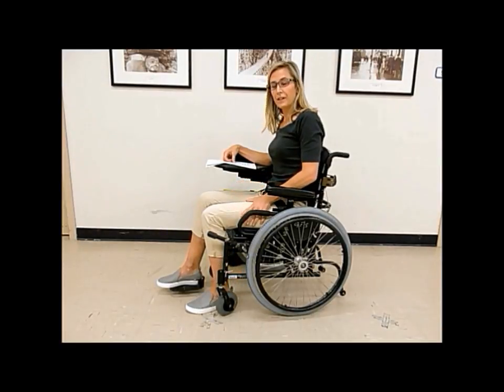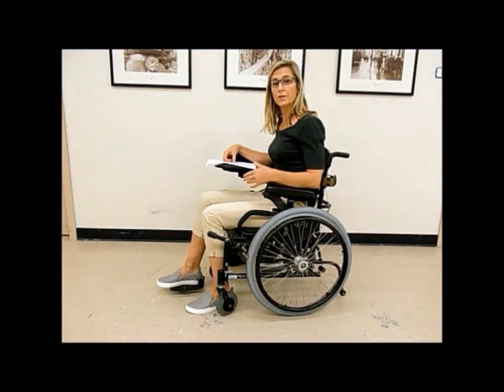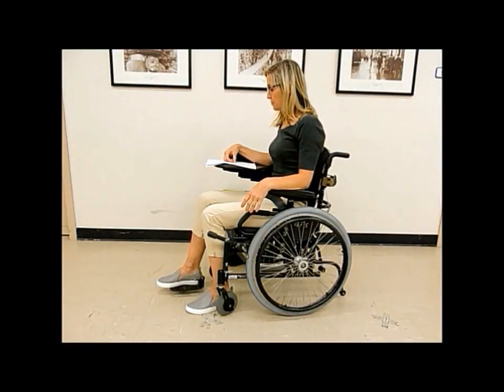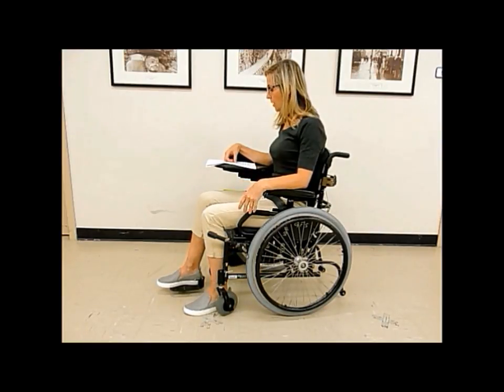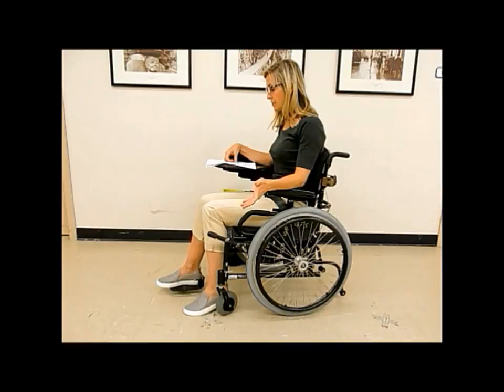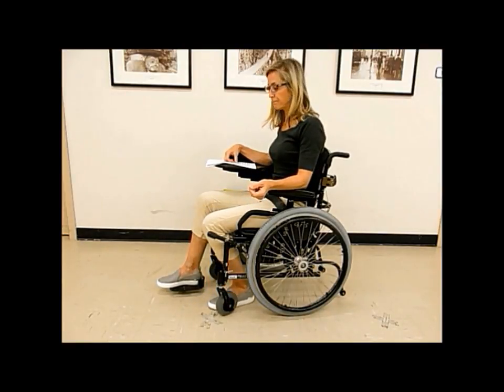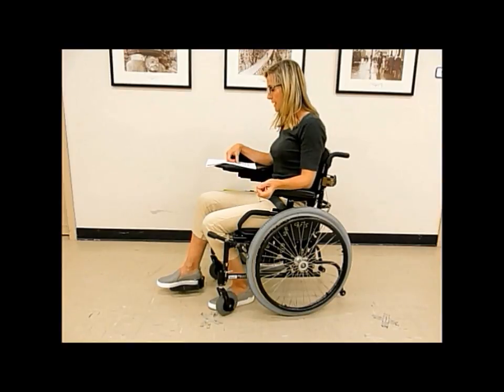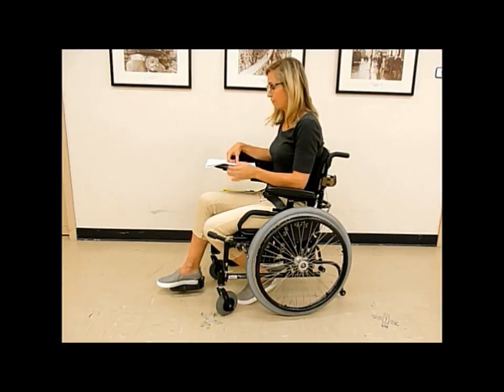A foam cushion is typically more appropriate to allow for more stable base rather than something like a Roho, which is an air cushion, which provides more pressure relief but less stability while you're wheeling. Of course, if the client has skin issues and requires a pressure relieving cushion, that will take priority. The cushion may need to be cut down on the leg trough for the propelling foot or built up under the leg that's supported by the footrest.